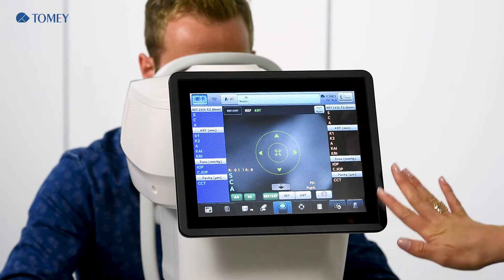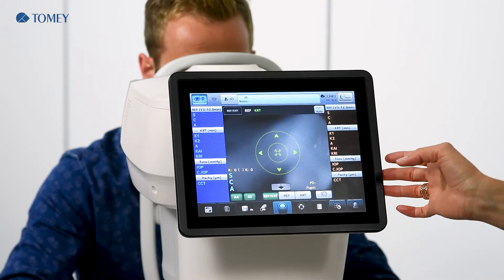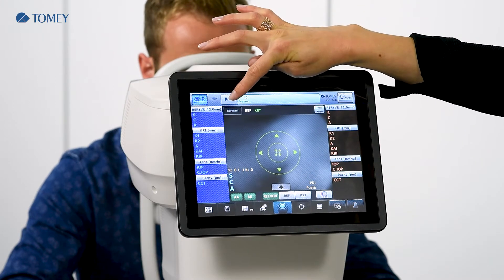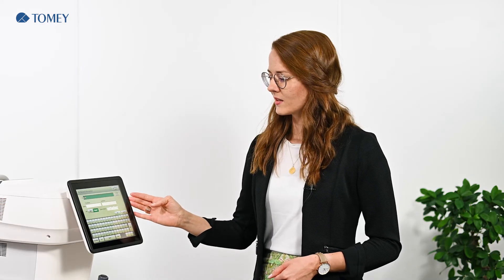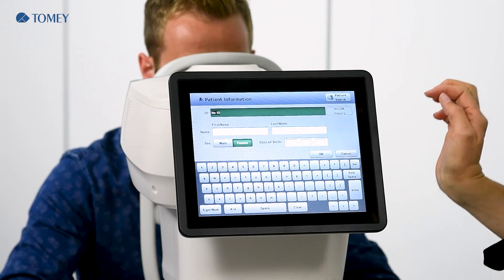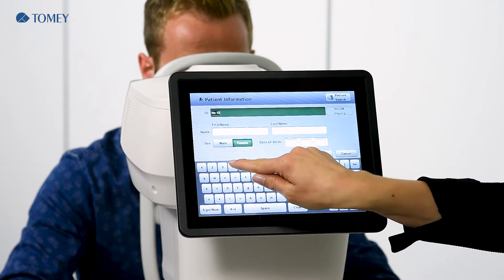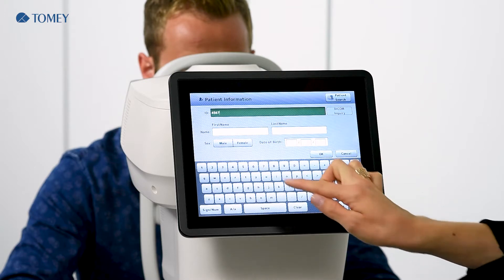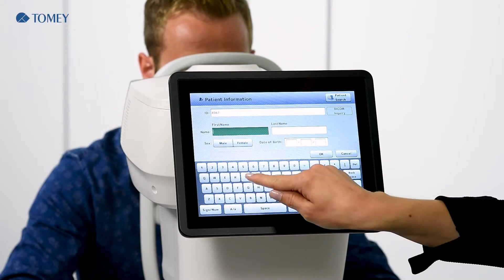First, after startup, you will find this display and we start with creating a new patient. You can easily go to the ID button and here you will find the interface to enter a new patient. It is up to you if you want to enter an ID or not. In this case, we will start with a number ID, just as an example, and the name — we will have a test patient.